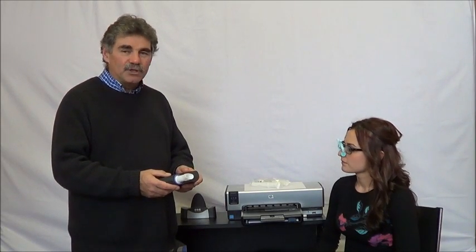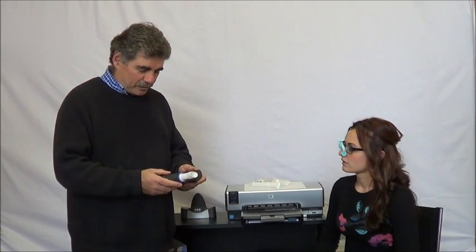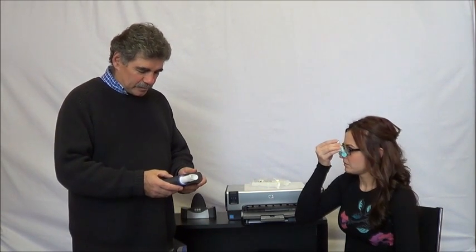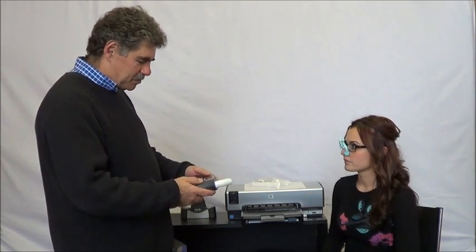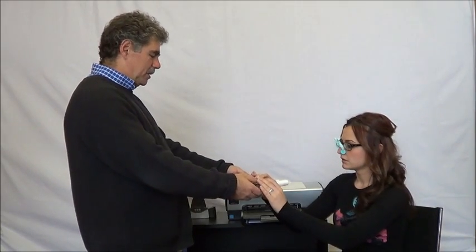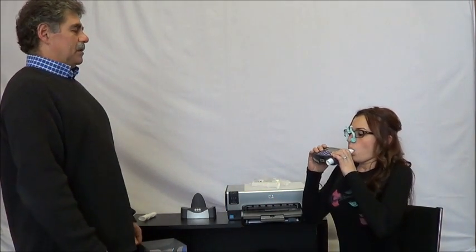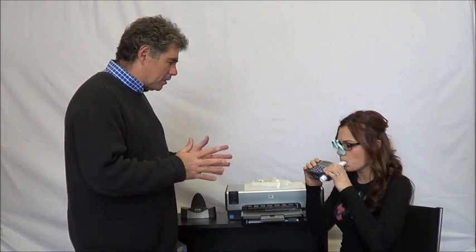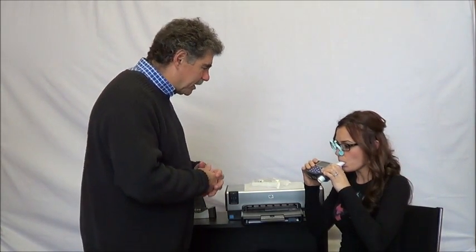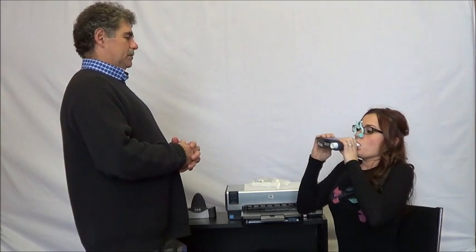We've done two good efforts so far and we've got one more to go. I'm going to press Next here and we're ready to go for the next effort. It says 'blast out,' so we're ready. Bianca, fill up. Blast — go, go, keep going, push, push, push. Big inhale. Very good.